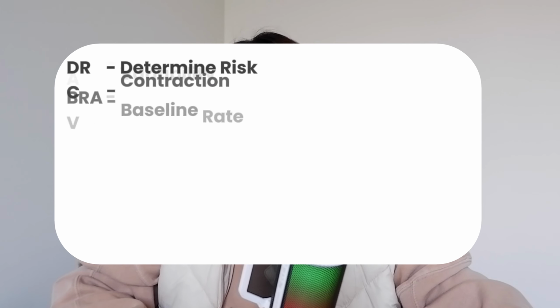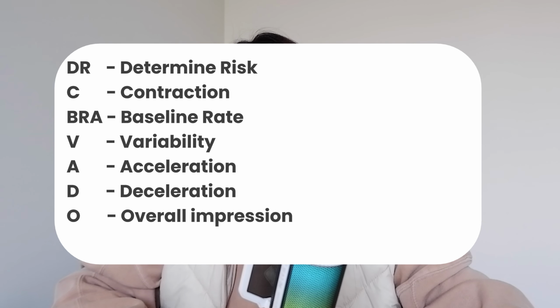Dr. C. BRAVADO is a mnemonic that is widely used in Australia for CTG interpretation. Each letter stands for a specific feature that you assess in a set order, and the order matters because it stops you from jumping ahead and missing something important. DR stands for determine risk, C for contractions, BRA for baseline rate, V for variability, A for acceleration, D for deceleration, and O for overall impression.